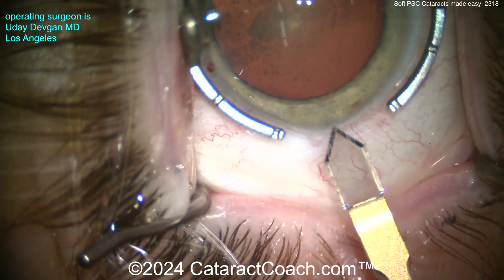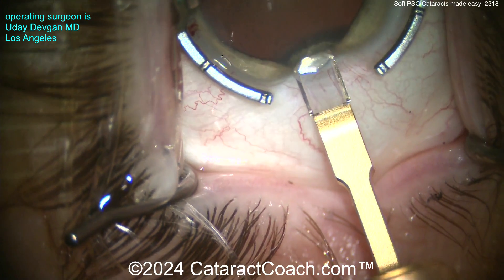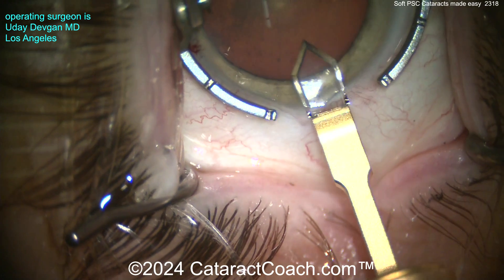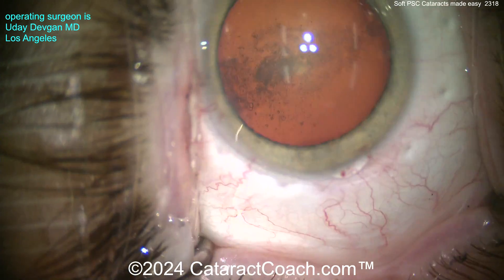We're making a phaco incision here temporally using a diamond keratome — nice and easy, advancing it. This is a 2.0 millimeter blade, so we'll slightly enlarge to about 2.2 to 2.4 millimeters.